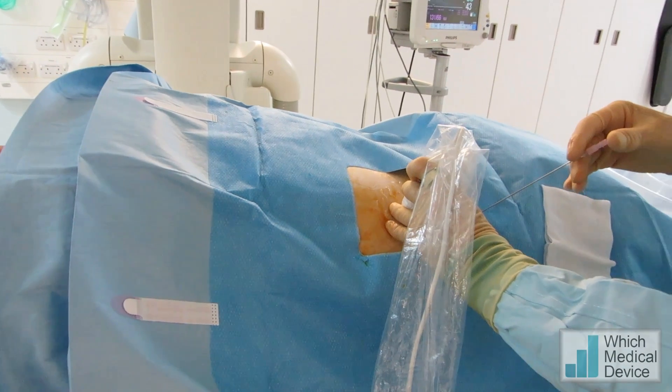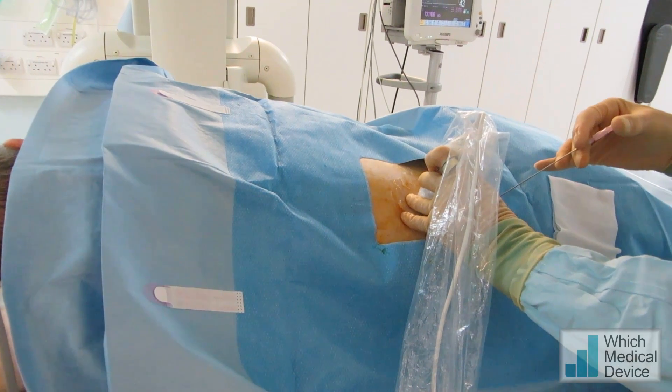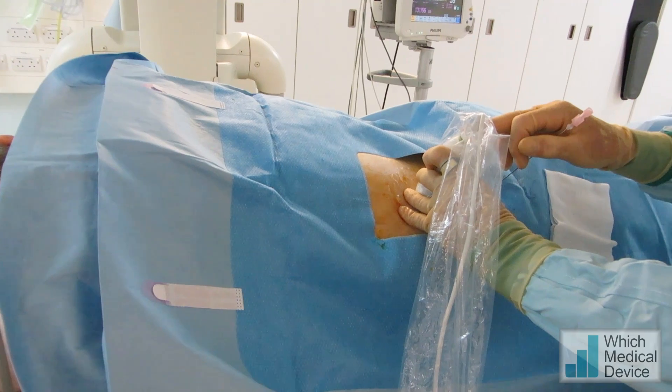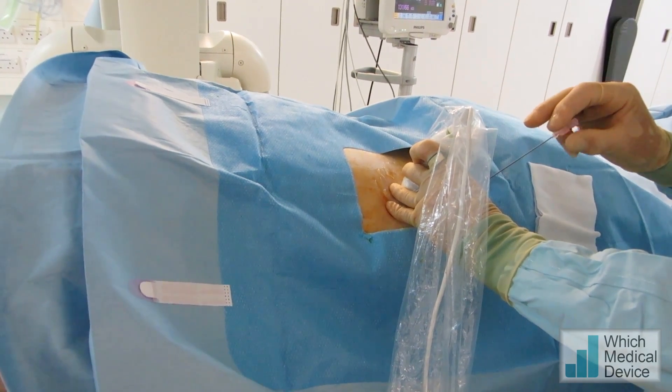We're doing a nephrostomy here on a grossly dilated system using the Philips Lumify system, which is ultrasound essentially based in the probe, connected to an Android device. In this instance we've got it connected to a small Android phone.